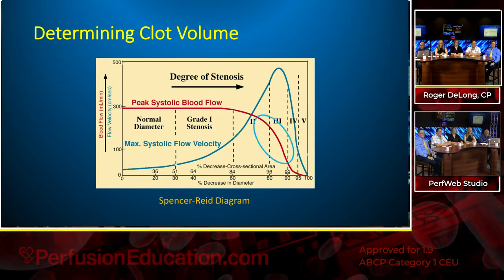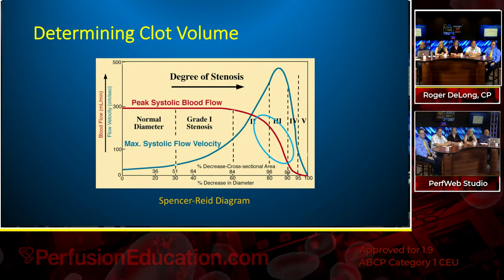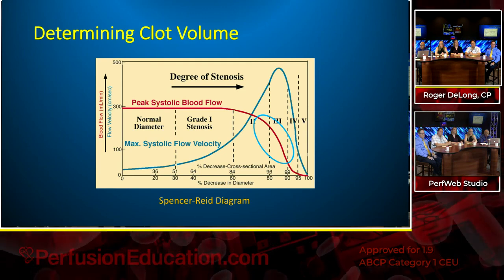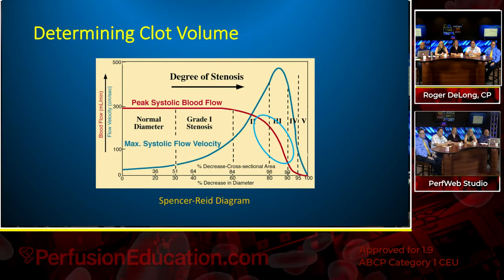Next picture. So you get a lot of a drop in that later period, and flow is inversely proportional to pressure. So you would have a mirror image steep incline only as a late sign in the oxygenator. It's completely dead. Good. Okay.